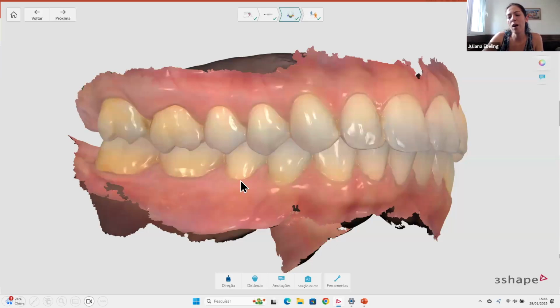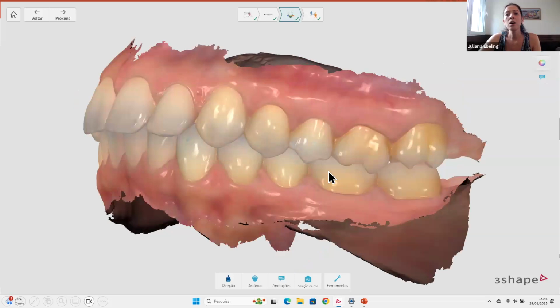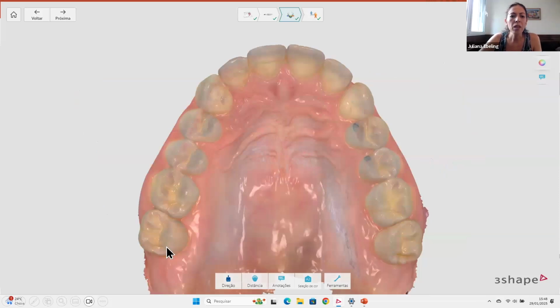Here I have what we would say is a perfect contact distribution, contact position of teeth with a good anatomy. And let's see what is really happening. This is a patient with a class 1 canine relation, class 1 molar relation. To the other side, exactly the same way, with a good condition, with no caries, with a good occlusal anatomy. But this patient has a symptom of sensitivity in these premolars.